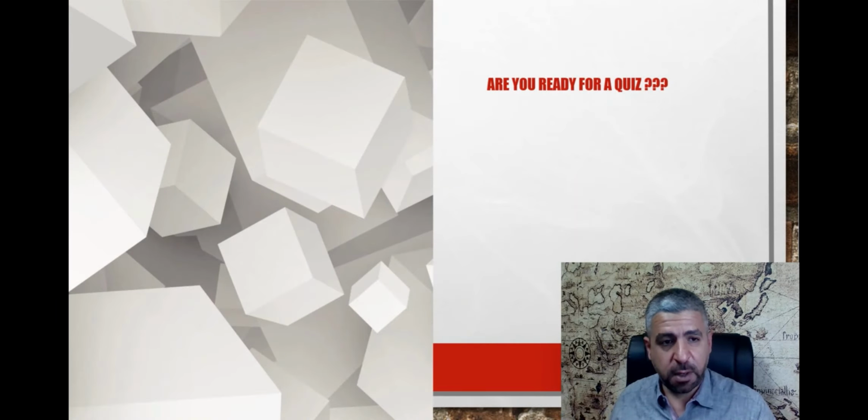Are you ready for our quiz? I promised you we will have 5 slides. All you have to do is say benign or malignant and why. If you like to write it in the comments, that's okay. If you want to keep it to yourself, it's also okay. And on Wednesday at 5 p.m. Baghdad time, there will be a short video explaining the 5 cases and why they are benign or why they are malignant. Okay? Keep watching. I'm going to see you on Wednesday for the answers.